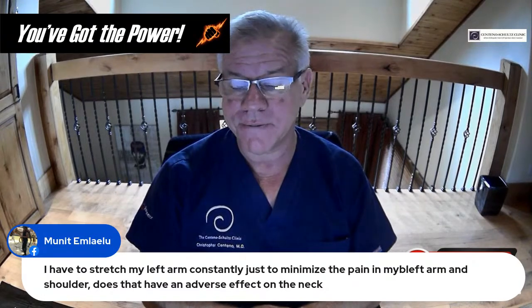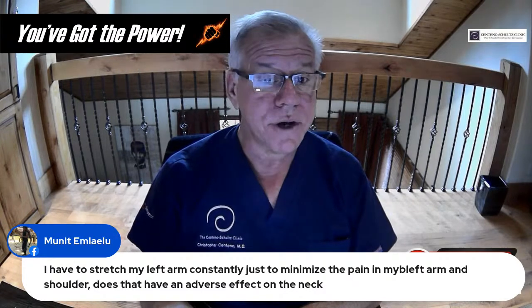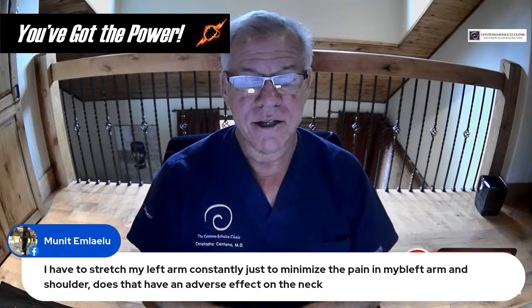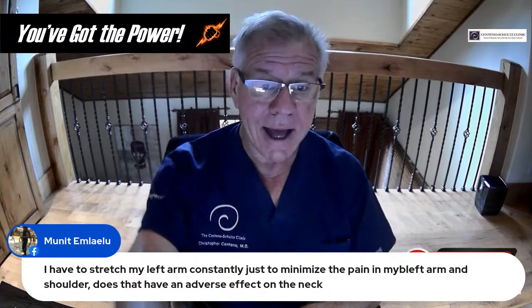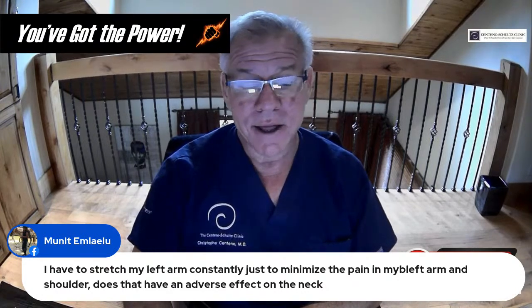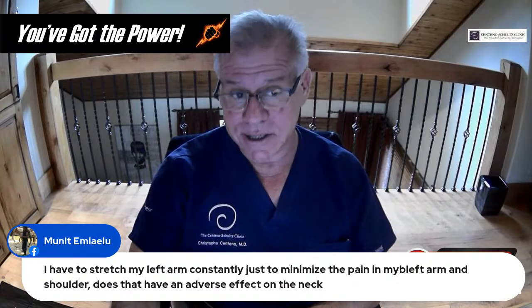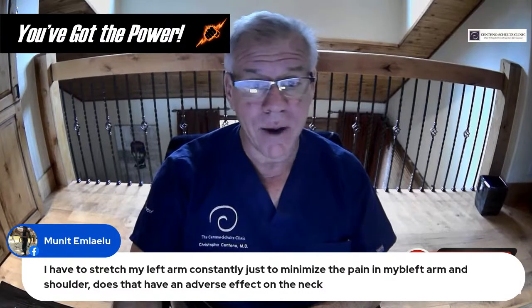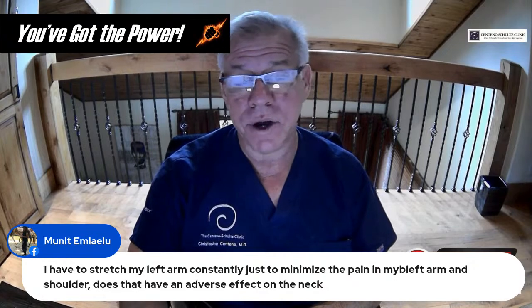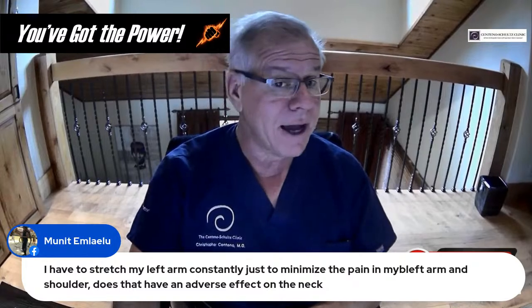And like I said, on Monday we're going to focus on how to get a DMX done in a country or place that doesn't have DMX accessible. What I'm going to try to do is go over what that will look like so that you can understand what the directions mean. And then I'll probably put a link to a paragraph that you can give to the radiology tech to say, hey, this is what I want you to do. So hopefully that'll help some people who don't have access to a DMX to get that C1-C2 overhang. It won't be quite as good, but for a lot of patients, it'll be good enough.